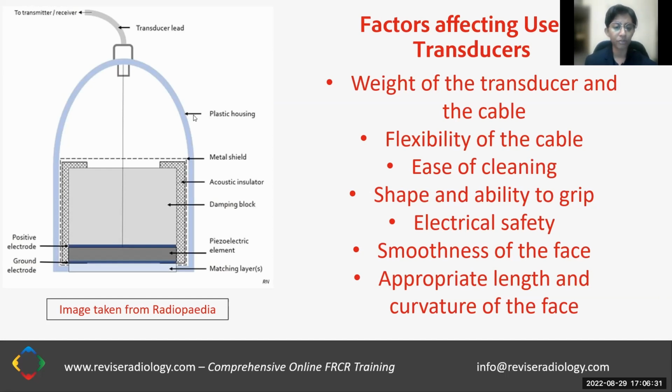However, the most important factors include frequency, depth of the lesion, the dimensions of the transducer, and whether it's going to create a 2D or 3D image. So those are the correct answers, and we did get those in the chat. So let's keep going.